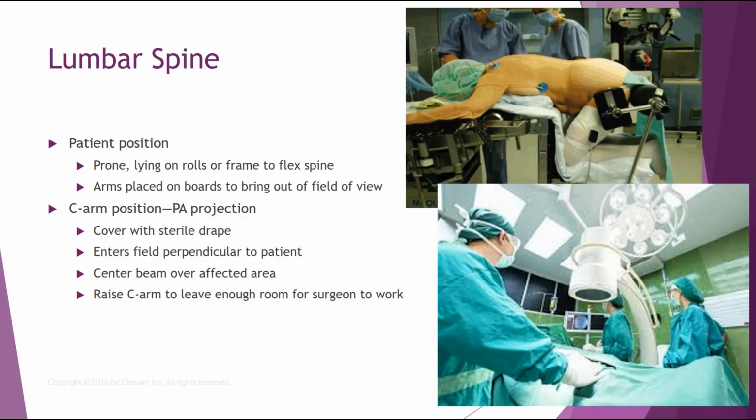Okay, lumbar spine. The patient position is usually prone, for obvious reasons. However, there are always exceptions. They do anterior approaches. It helps them to separate the bodies of the vertebra if they're going to do a disc implant.